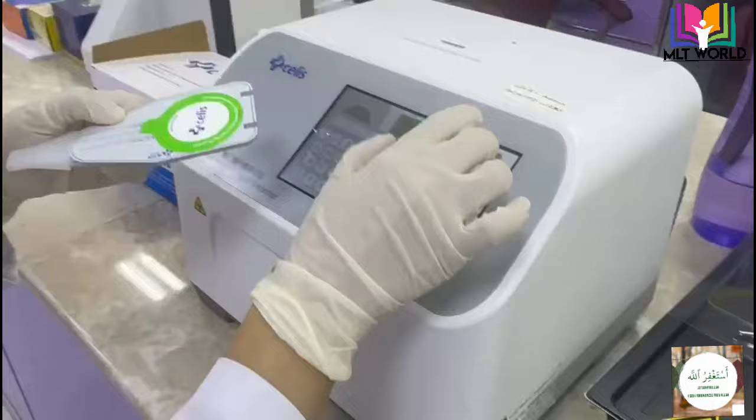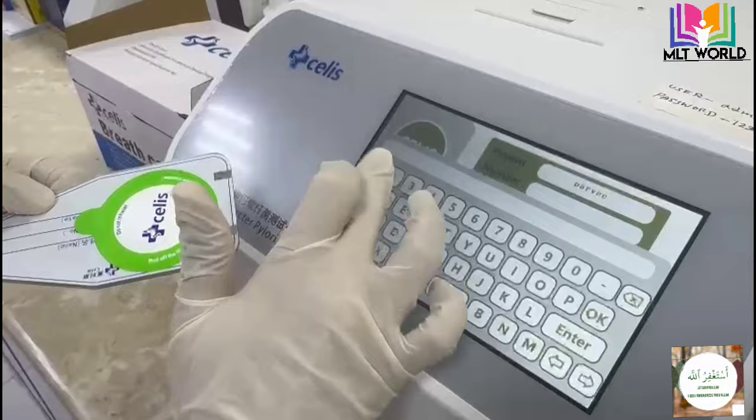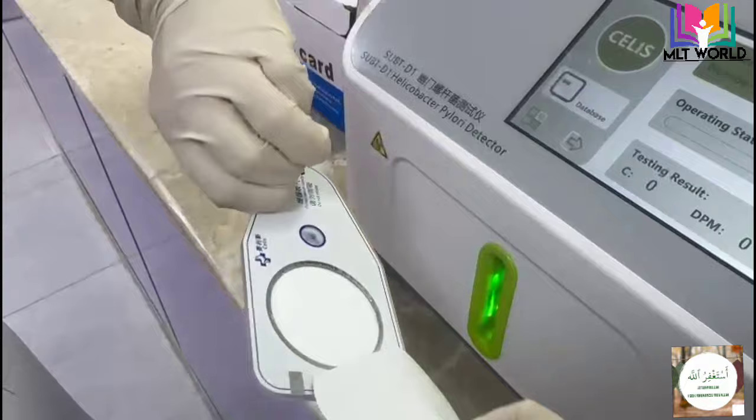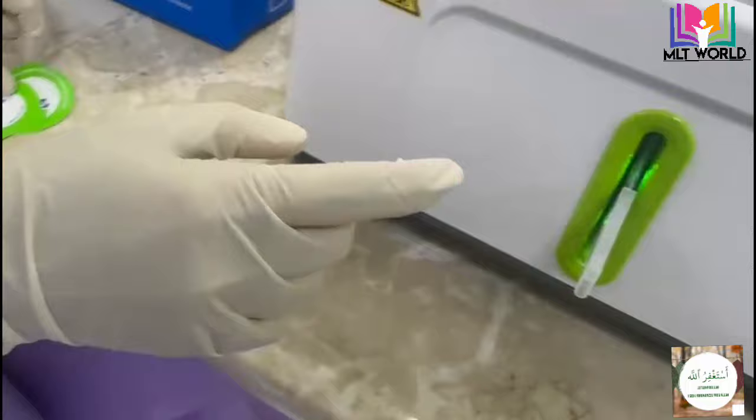After that we will enter the patient's name and ID number into the machine. If you have not seen the machine demo, I will put the video link in the card. Now we will remove the stickers from the card. You can wait up to half an hour after the breathing is done before running the card in the machine — it is not urgent.